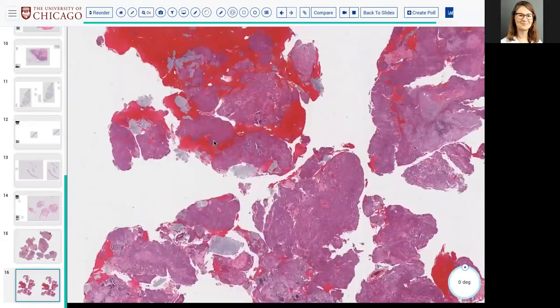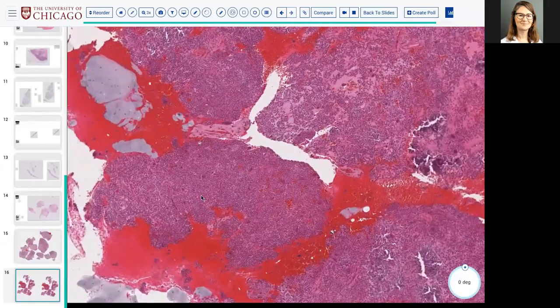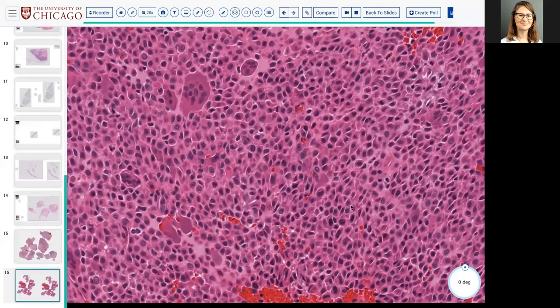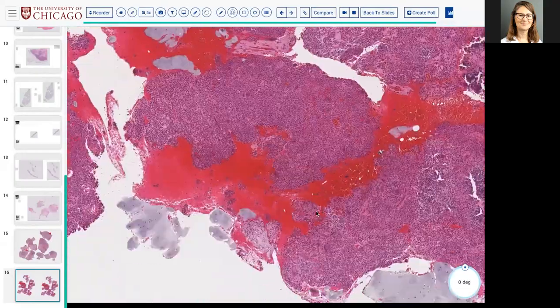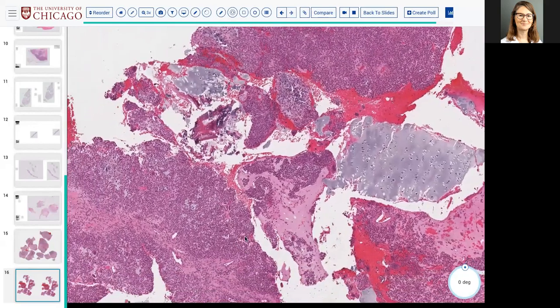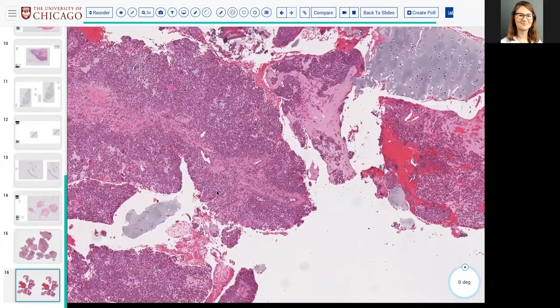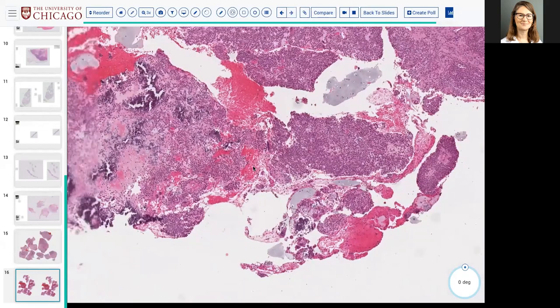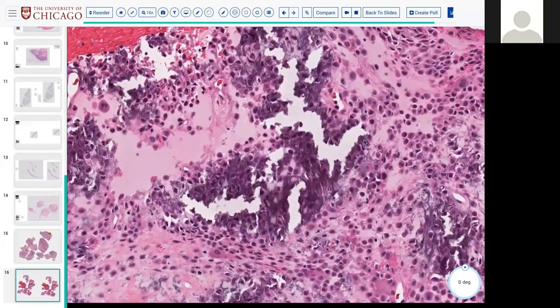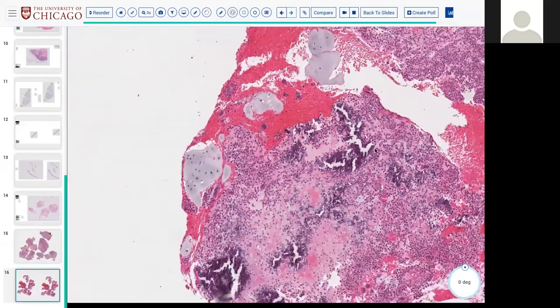All right, so this is another bony lesion in a young person, with cartilage, with giant cells, with some, like you said, some fine calcification. So what are your folks' differentials? There's your calcification. Like a chondroblastoma. Yeah. Great.